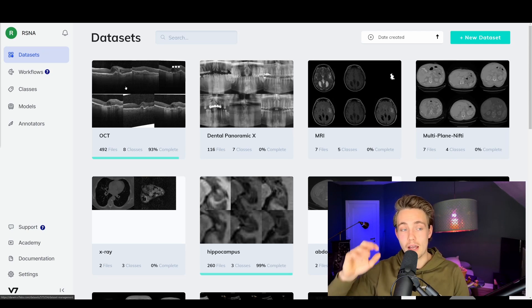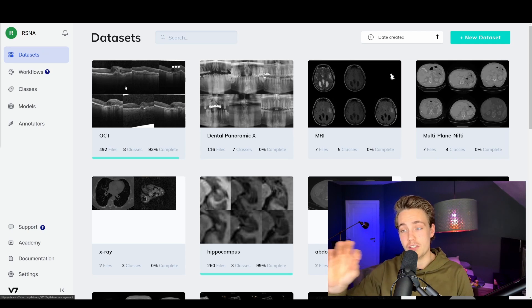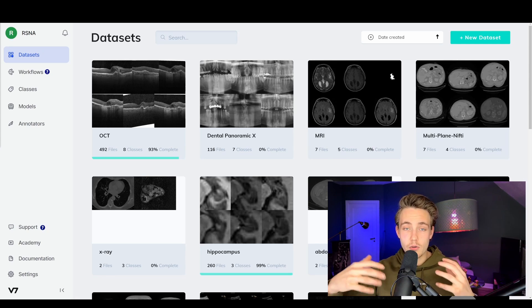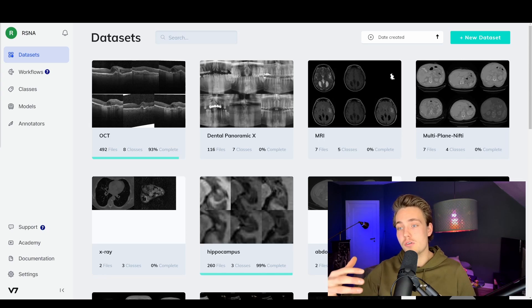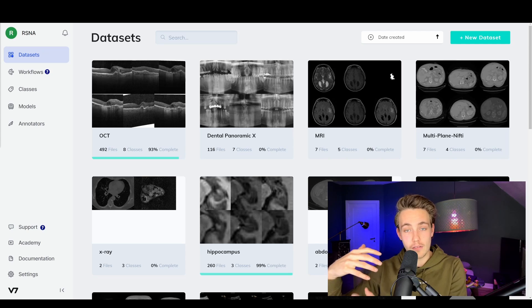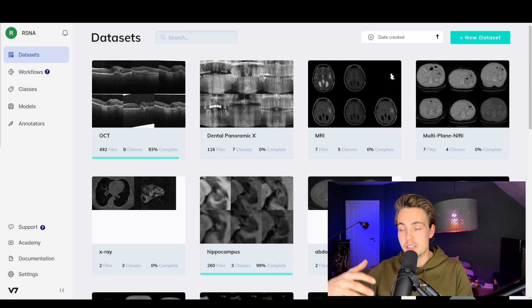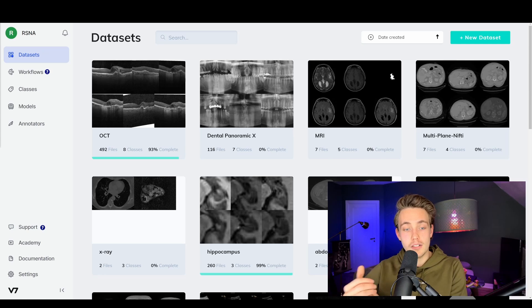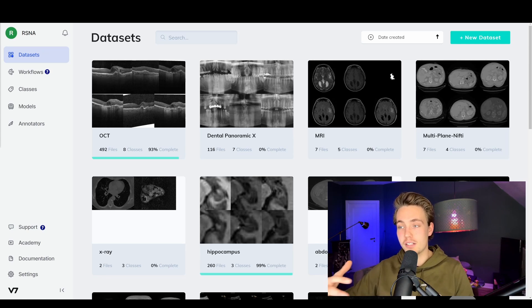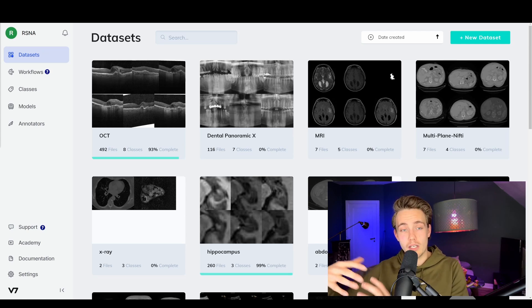This is actually a pretty cool platform. They have a lot of different features for annotating medical images, and it's actually the only platform I know of that has all these different features for medical images. We can have different views of these files when working with volumetric data, so we have this DICOM viewer experience when we go to label our data.